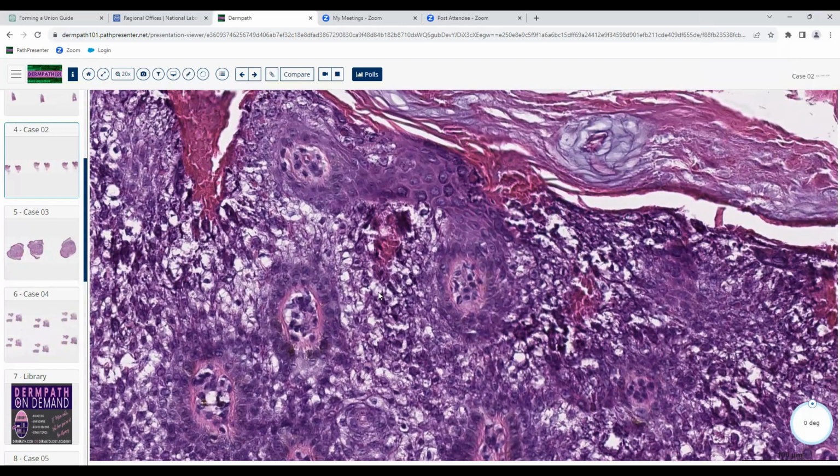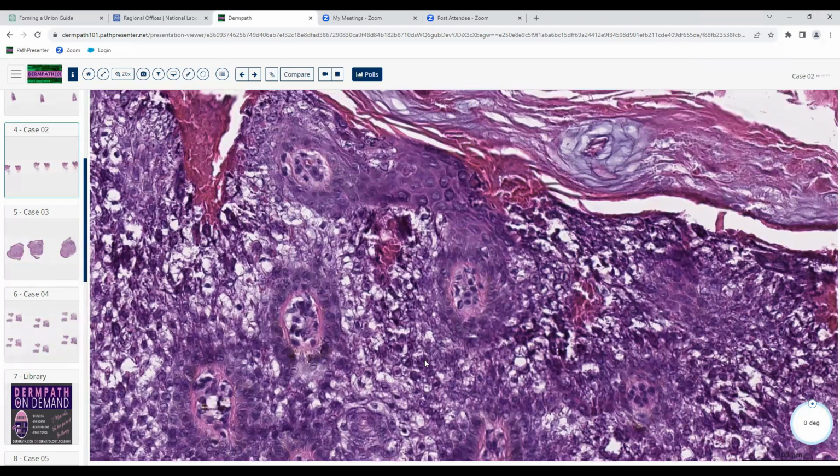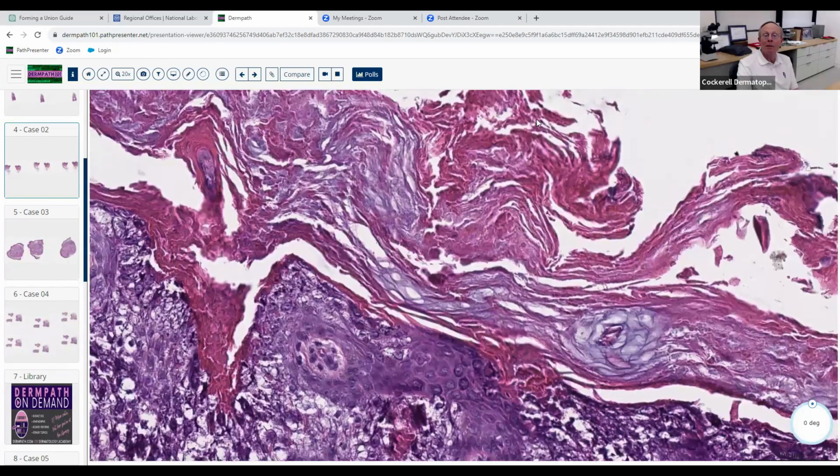Okay. Got this white color, and then in other areas they've got this pink hyaline almost color up here. And the keratinocytes are hyperchromatic up here. Notice here, kind of normal. And then up here, they get more hyperchromatic. And then here you've got this red abnormal cornification going on. Okay. Yeah. And it's prominently hyperkeratotic. Yep. Okay.